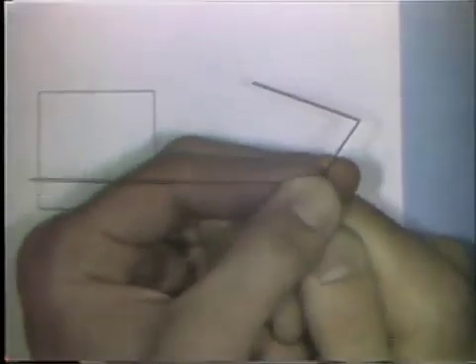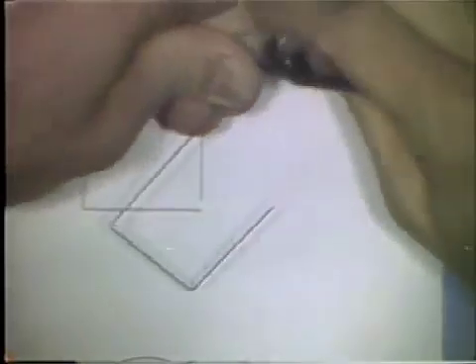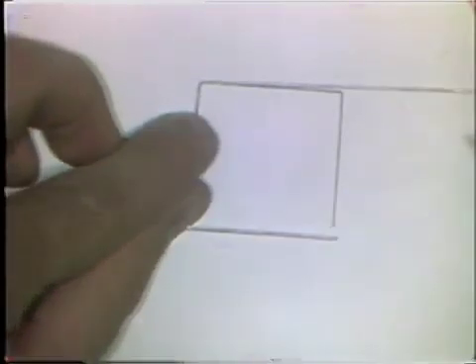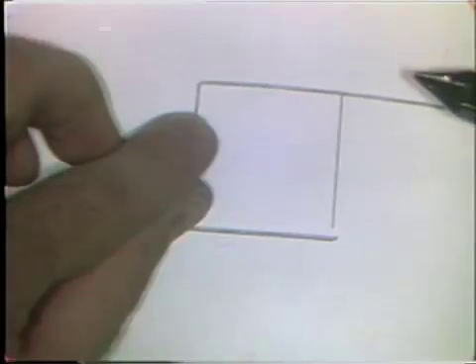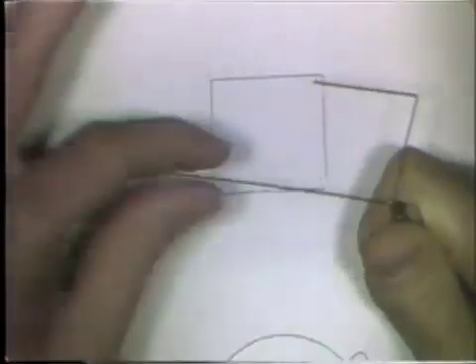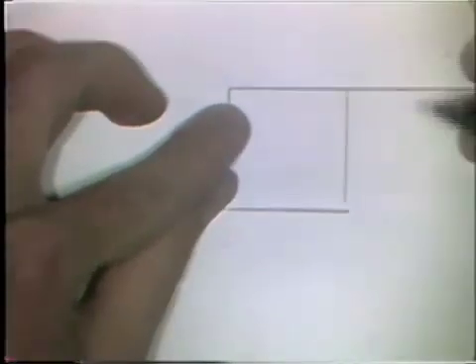You complete the 90-degree bend by again carefully orienting the wire in the pliers and pushing the wire over the round beak a little at a time so you maintain the flat plane in space as you're bending the wire. Check the wire on the pattern. A little more bend is needed to bring it directly over that line. You place a little bit more bend into it, try it back on the pattern. Then you check the flatness of the wire.